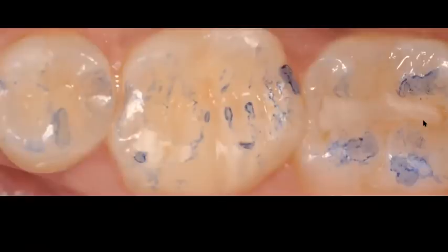I have to grab a burr and reduce it so that he can feel like it's not in hyper contact. But what do I end up doing? Look at all the areas of the tooth, lingual cusp and buccal cusp, inclines that are in contact that shouldn't be in contact. So I am altering and modifying the way that this tooth comes into occlusion. Look at my restoration. I have the buccal cusp, I have the central fossa.